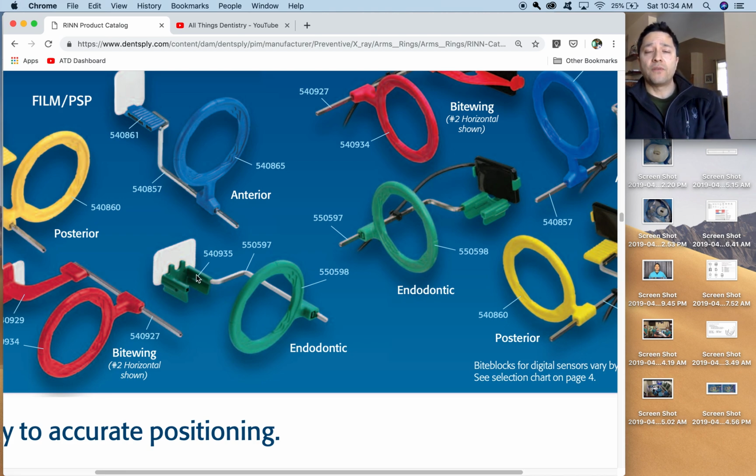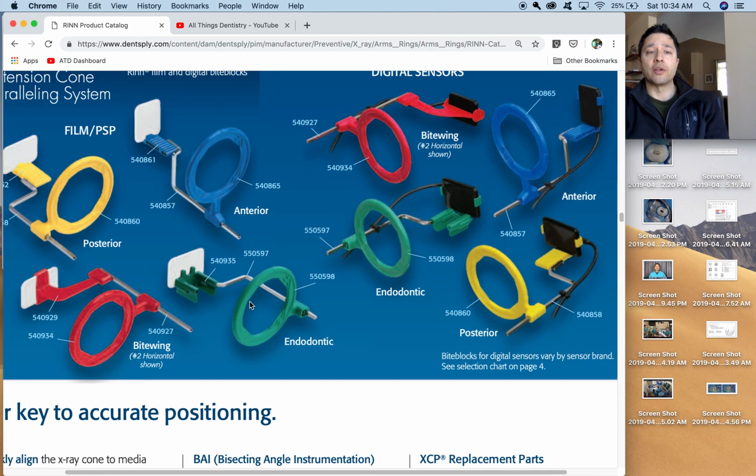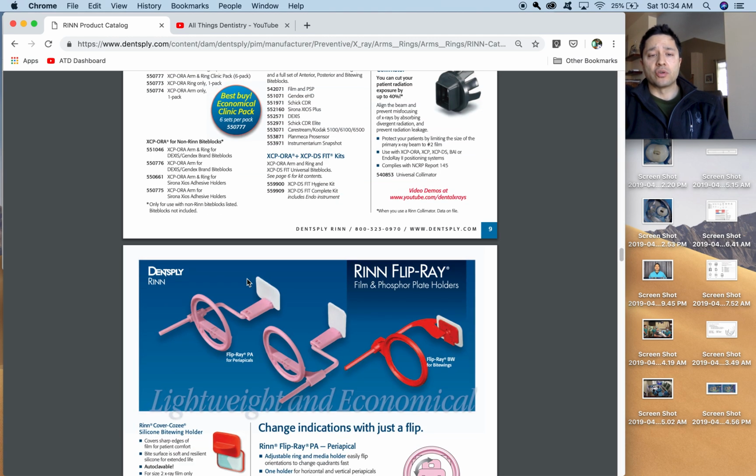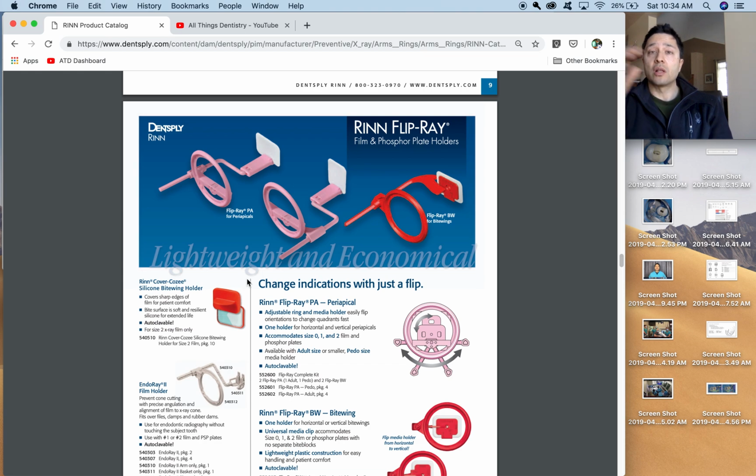With the phosphor plates, we use this right here. You order these pieces together, and all the phosphor plates seem to be all the same. And then off you go. You've got your endo holder. Now, I've used those for a year or so, practicing, getting better, because a lot of the time my problems were, where do I line the tube up to? I have the X-ray. I think you can understand what I'm saying.